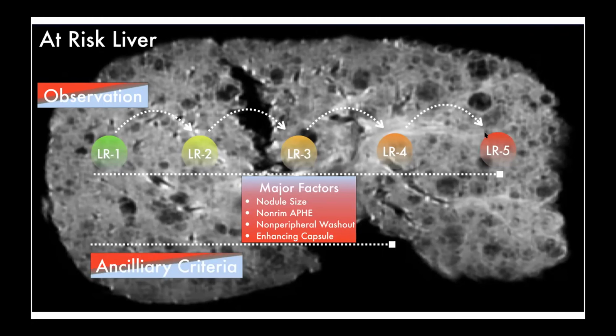Failure to give contrast can be due to many reasons. It could be that the patient has a contrast allergy, the patient refuses contrast, or the patient has underlying renal dysfunction, a potential NSF candidate on hemodialysis. You know that you want to be safe with these patients, so you may not give contrast. So how do you overcome this? You can overcome this pretty easily. You can do the contrast enhanced ultrasound or a targeted contrast enhanced ultrasound, and you can try to categorize or characterize this observation, because the contrast used in ultrasound is not affected by the underlying renal profile. Now, that's something which is not going to be part of this lecture. I will touch base on this at a later time.